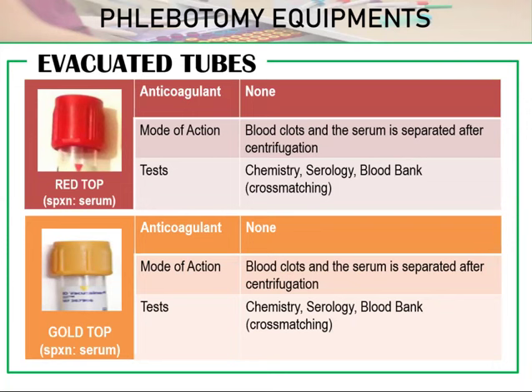As what I have mentioned before, after centrifugation, the gel will be a barrier in between our serum and our red cells. Okay? So, the function is the same as our red top. It's just that it contains gel inside.